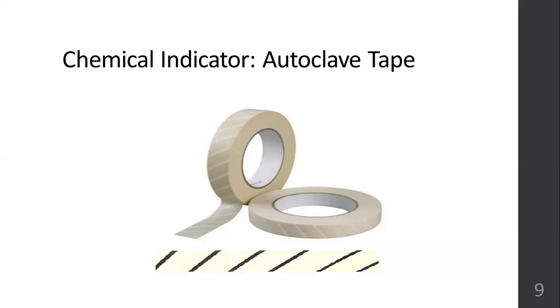Okay. For example, when placed inside the packs, if you are packing these chemical indicators over the sterile packs, they will confirm if the sterilant achieved a good penetration or not. Okay. They can be used as internal and external indicators also, based on what type of load release you are testing.